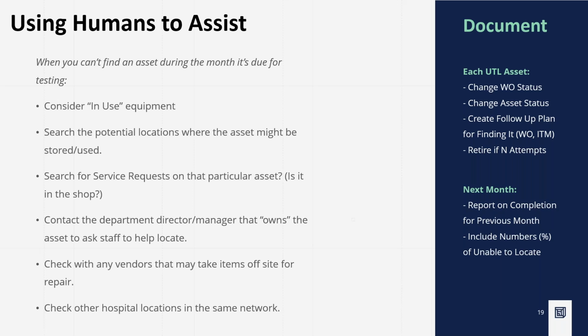And if we get any kind of information, either they bring it down if it's mobile, because we have 17,000 pieces of equipment in the hospital that see regular maintenance. If it's mobile, it's up to them, since it's past due, to bring it down. If it's not, then they give us locations, we send our techs up, and they put down their priority list based on what else they have, high risk being top priority.